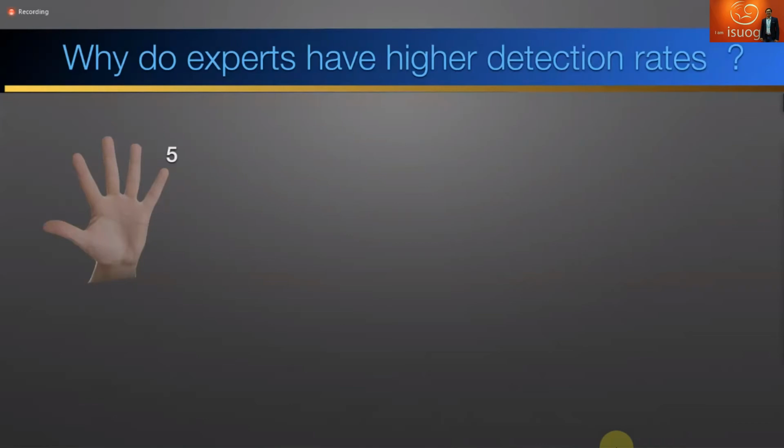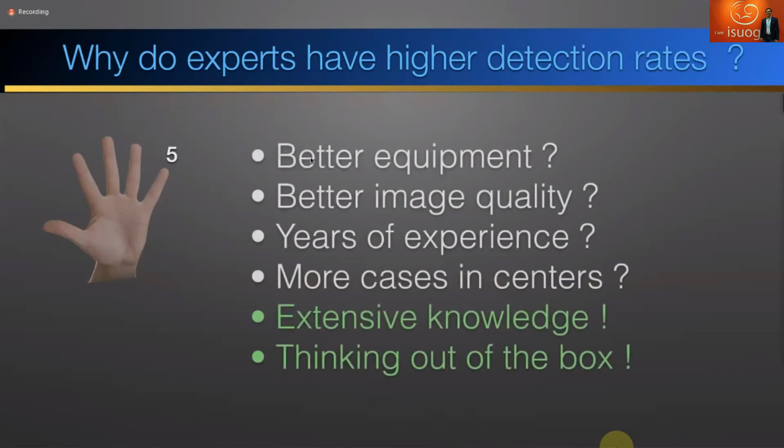Now, we have done the work of the professional, and now I come to the last group, asking why do you think experts have a higher detection rate? I hope you will agree that I have some expertise in this field because I have been doing this job for more than 30 years.